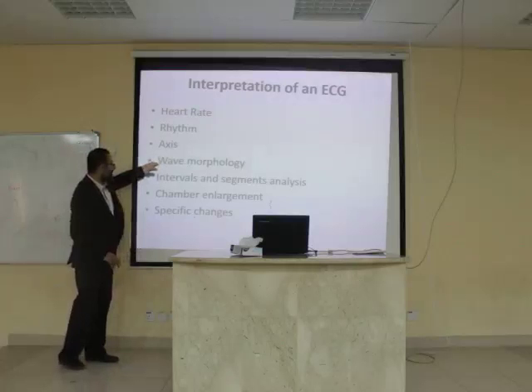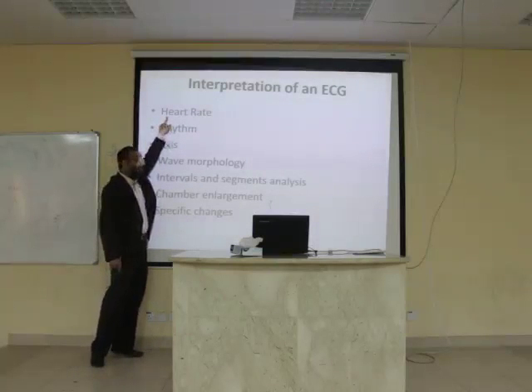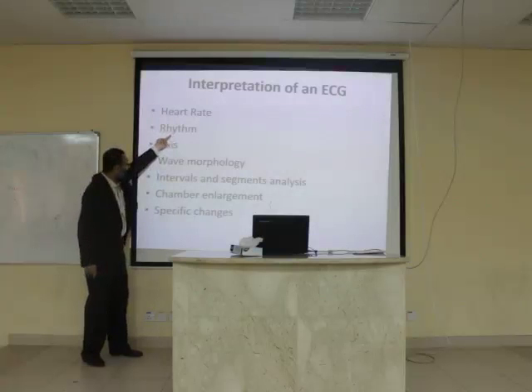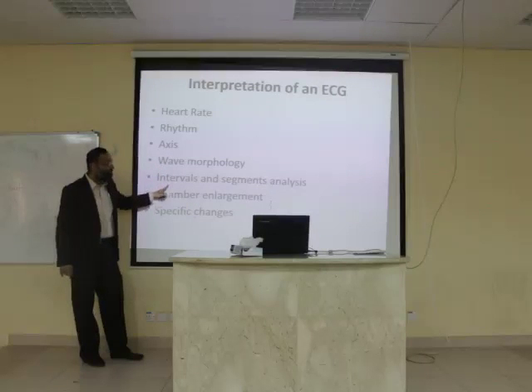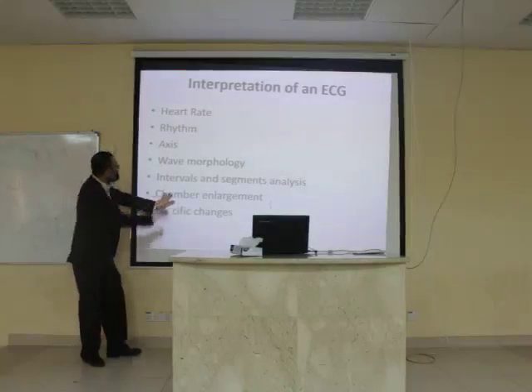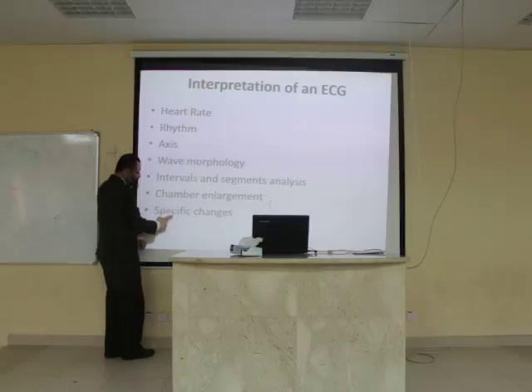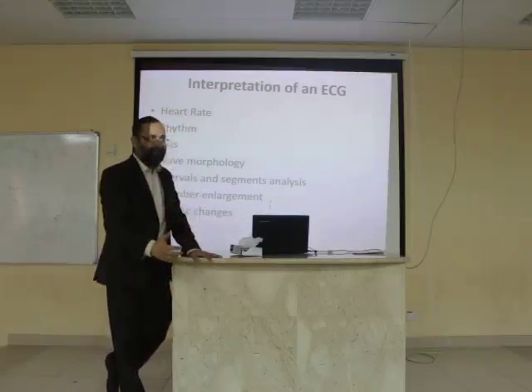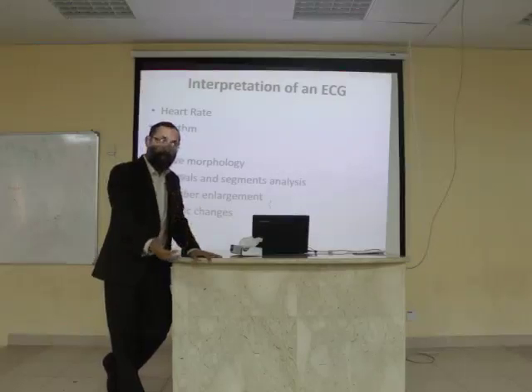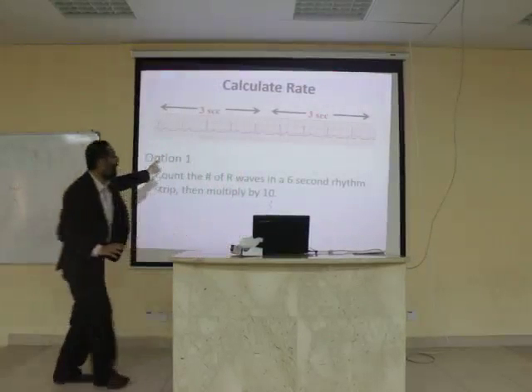But at your level, really, mark this one. Heart rate, you must know. Rhythm, you must know. To some extent, wave morphology, yes. Intervals and segment analysis, yes, you must know. For the other areas, axis, chamber, and specific changes, it's a little advanced, not the foundation of the ECG. You will learn, but gradually, with time, inshallah. Very quickly.